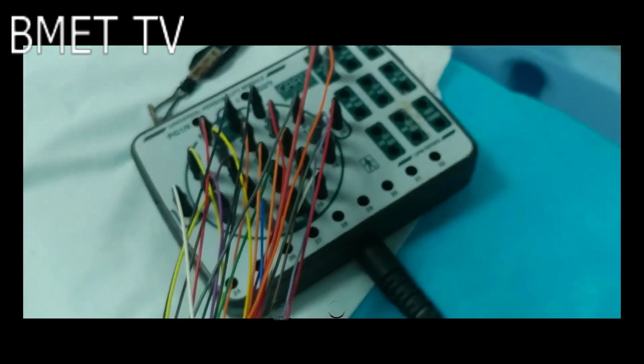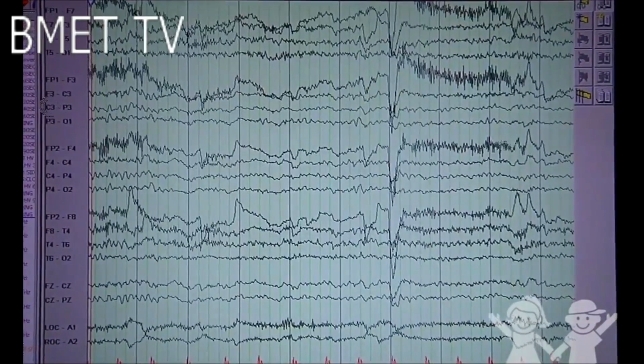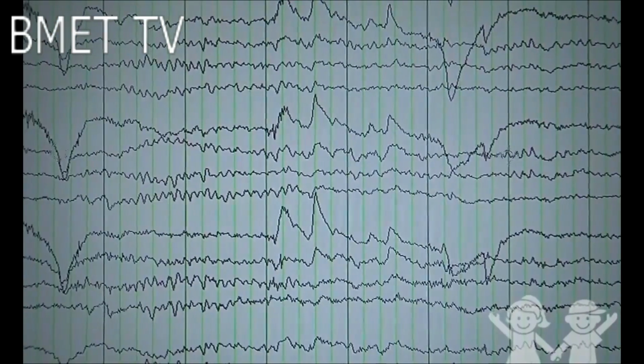Let's know about the EEG machine. EEG machines measure changes in the electrical activity a brain produces, not thoughts or feelings. These voltage changes come from ionic current within and between neurons. EEG machines don't send any electricity into your brain. They simply capture electrical signals that naturally occur as your brain absorbs and processes information.